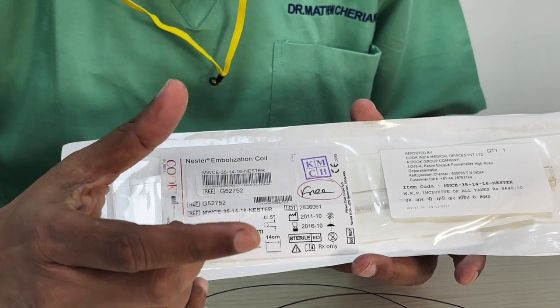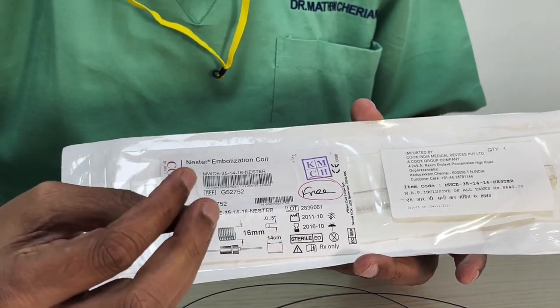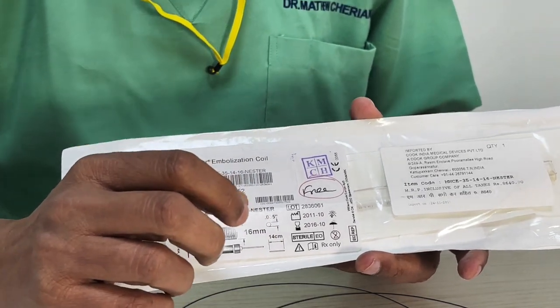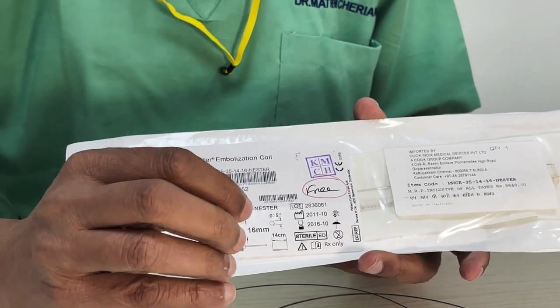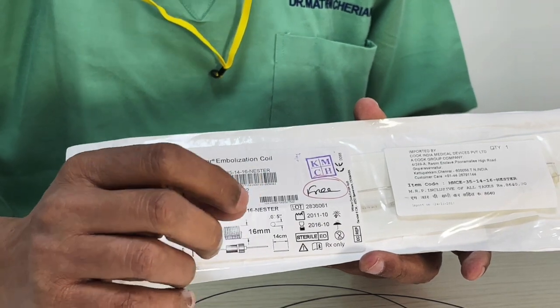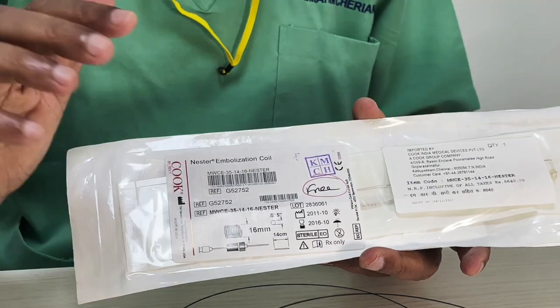Technically, for example, you have got enough length, and if the coil comes back a little bit or goes a little distal, it's not going to harm. So the position's accuracy may not be as much as with a device like an Amplatzer plug, where you have total control, or a detachable coil where you get much better control, or you can reposition.